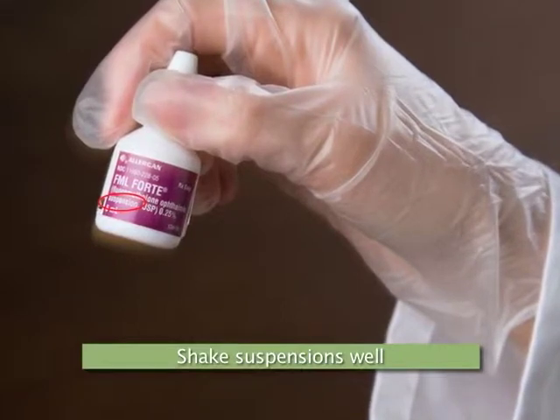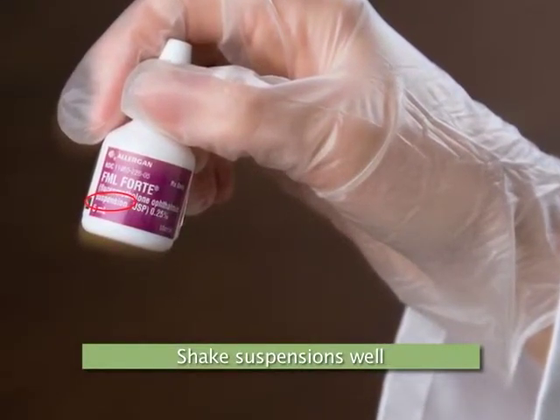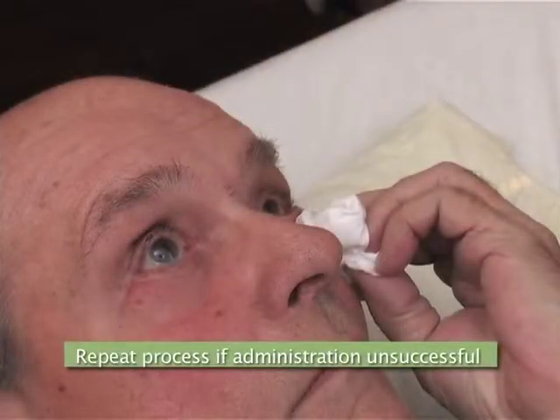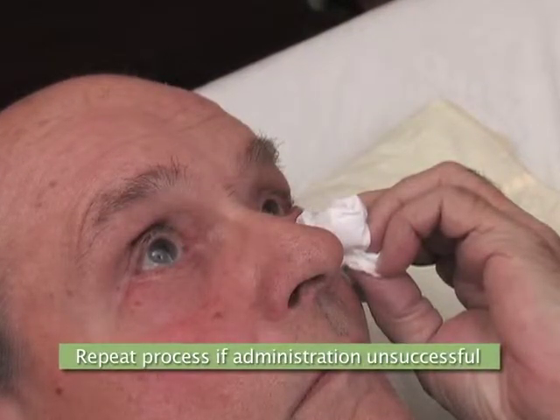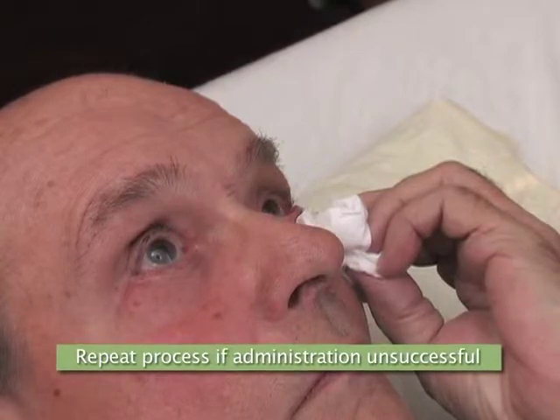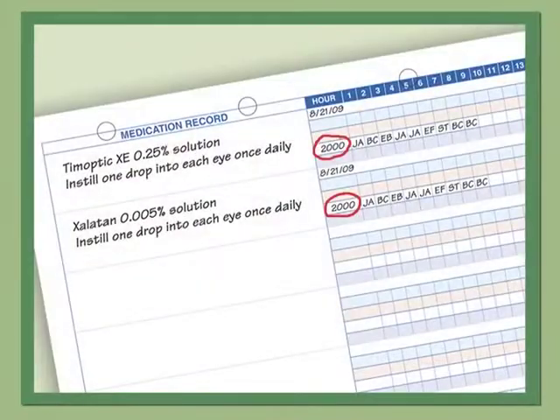If the eye drop is a suspension, sometimes abbreviated as SUSP, shake the container well before administering the first drop. This ensures that each drop contains the correct amount of medication. If the resident blinks or the drop lands on the cheek, repeat the administration process to ensure the medication is actually received.